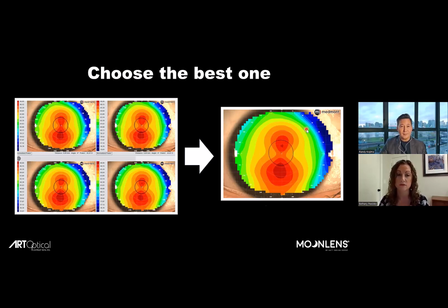So it is really important to spend that time. And the thing is, and I understand it is hard sometimes, like you said, that you send the patient off. They always live an hour away, it seems like, right? And so it's hard. They can't just pop back in. But the thing would be that if we get into the fitting, we say, let's go ahead and do it. Let's just pick this one and we're going to go with it.